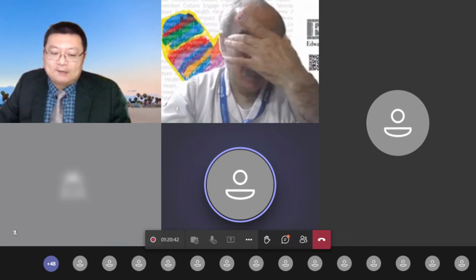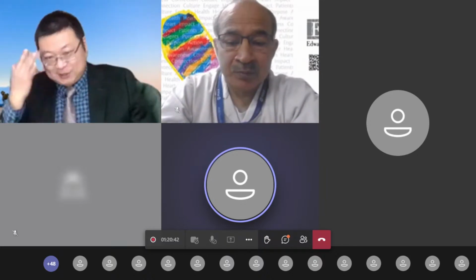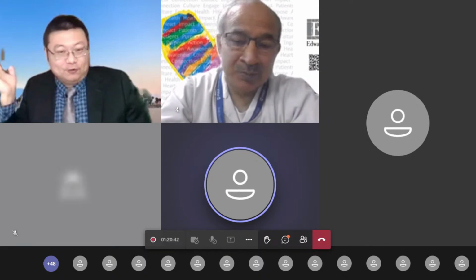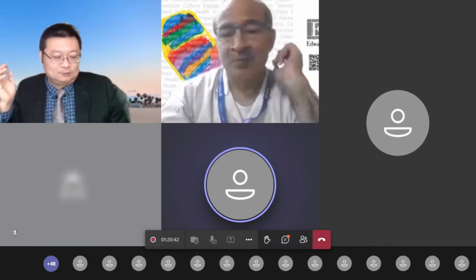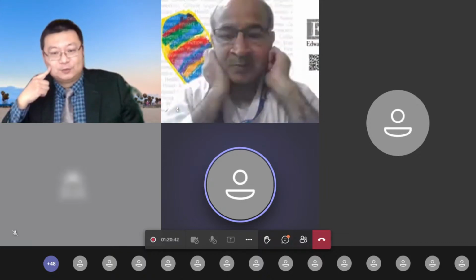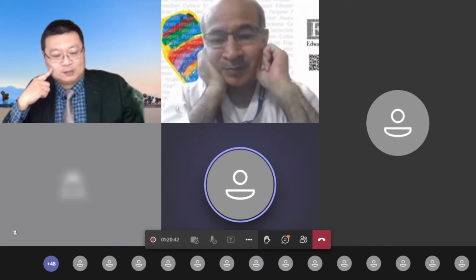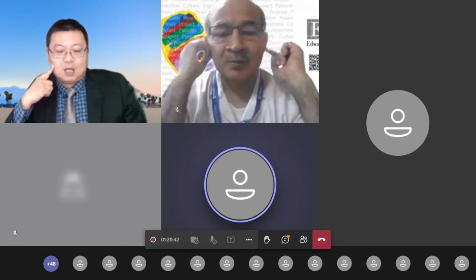So we have to reuse it. So the signal is just awful. So we do use NIRS, but it's really like a gambling, so we do not have too many strategies or methods to protect that.